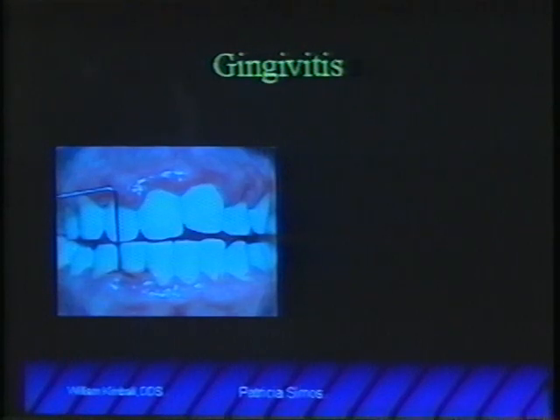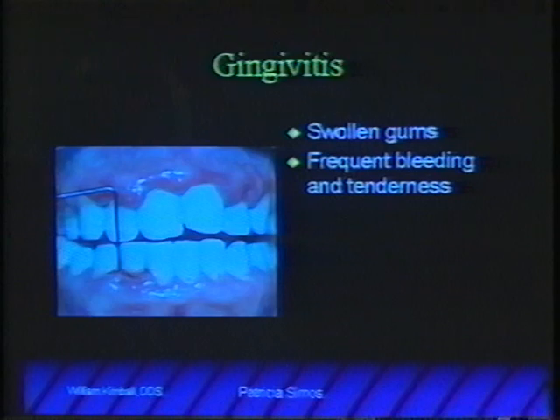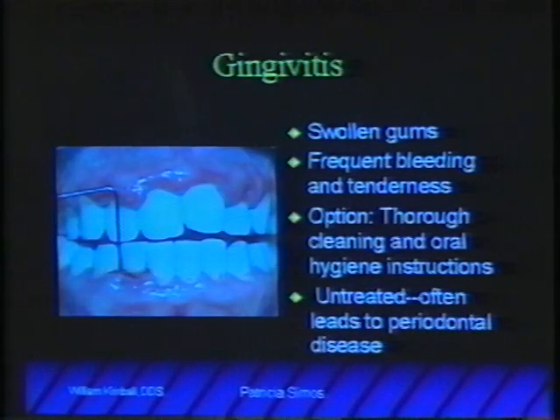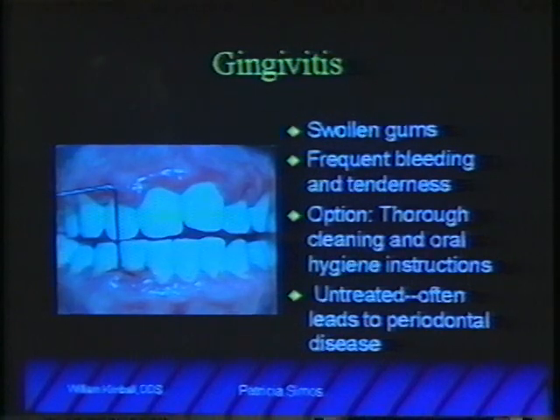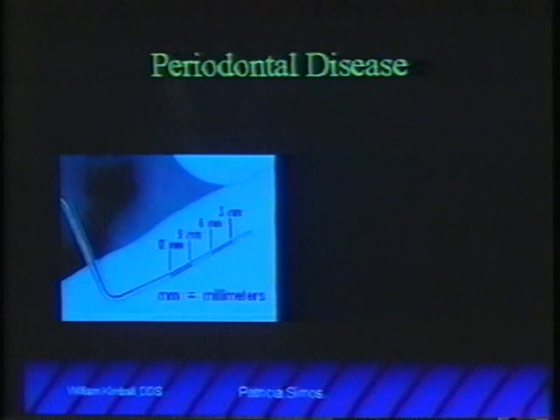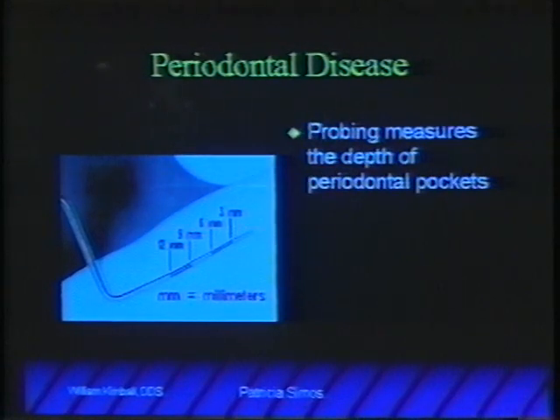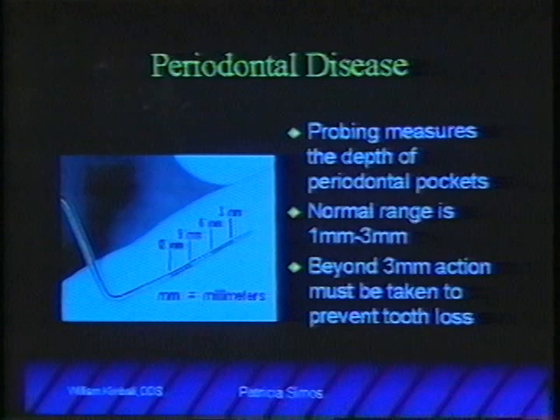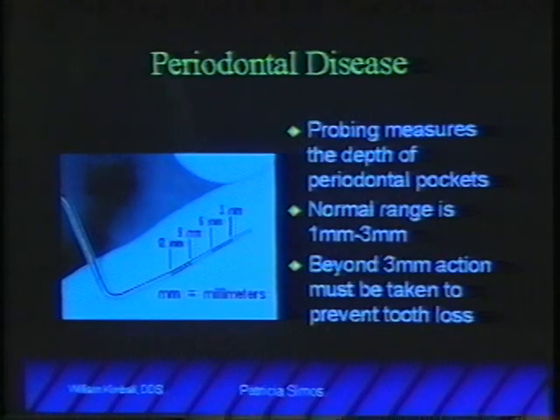Now you'll see a slide about gingivitis that describes for the patient what gingivitis is and how to take care of it. Notice that you can control how these bullets come in. Then you can see another slide with information about a perioprobe that also has text. And you can decide exactly what text to use.